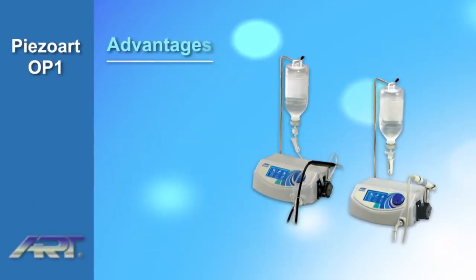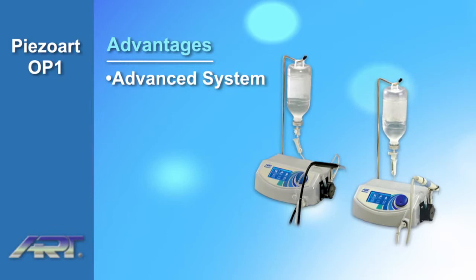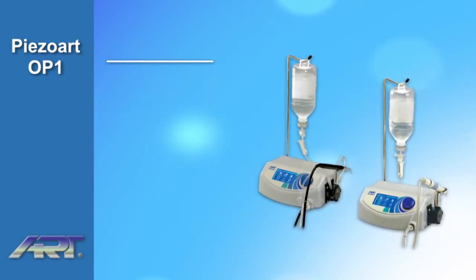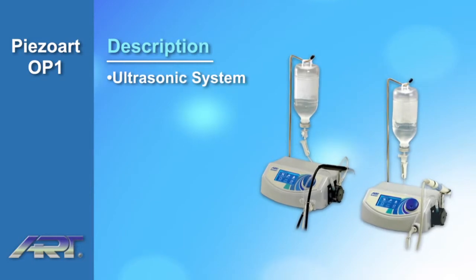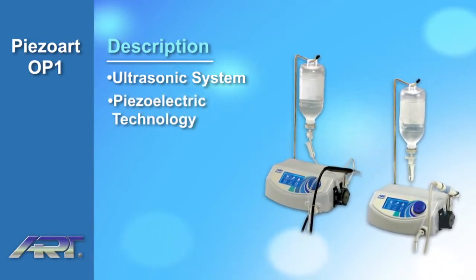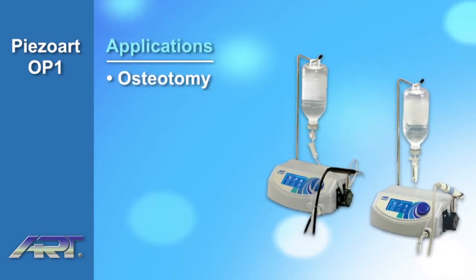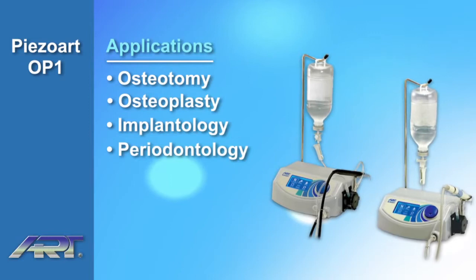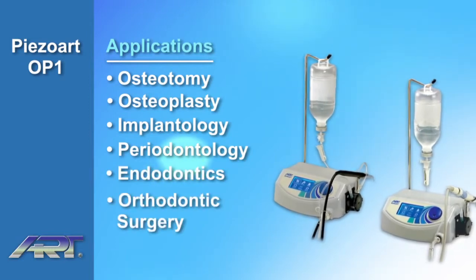The Ardiotomy Piezoart OP1 offers the most advanced ultrasonic bone cutting system at an affordable price. It is an ultrasonic bone cutting system driven by piezoelectric technology, designed for osteotomy and osteoplasty used in implantology, periodontology, endodontics, and orthodontic surgery.